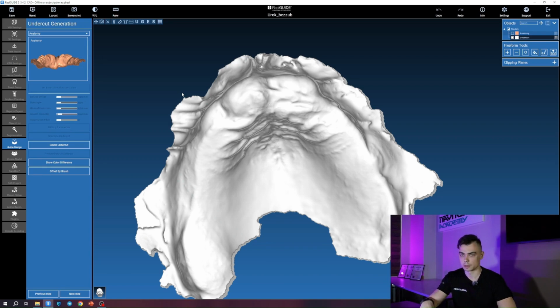With the mucosa, it's a bit different. And sometimes, for example, after surgery or during surgery, teeth are extracted and an impression is taken right away for a radiopaque template, or a scan is done immediately. And in this case, naturally, a tooth socket forms, and the mucosa in the area of the extracted tooth will change its shape every day over the course of 2 to 3 weeks.